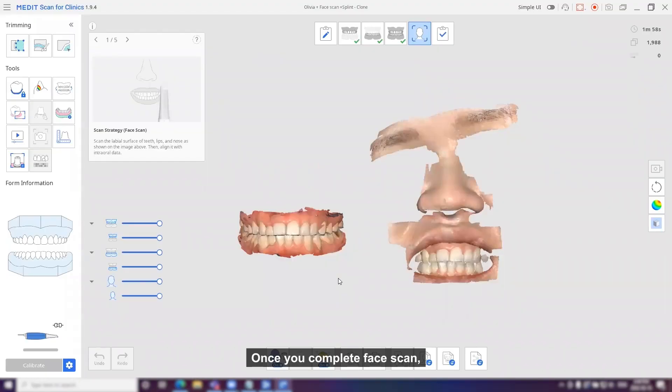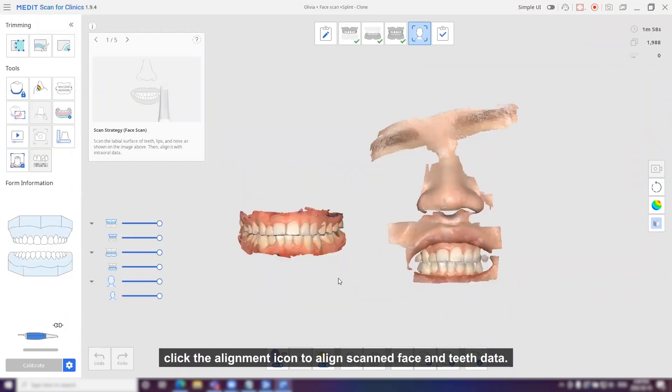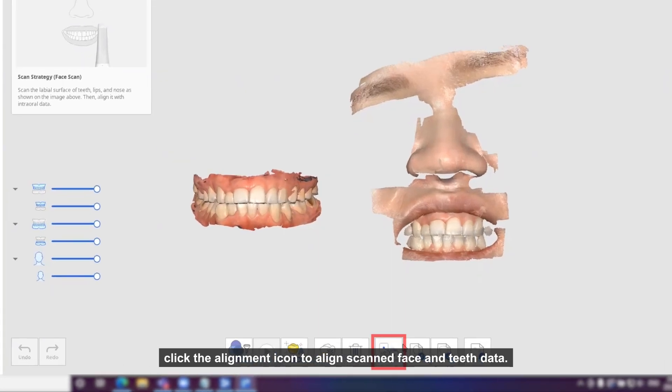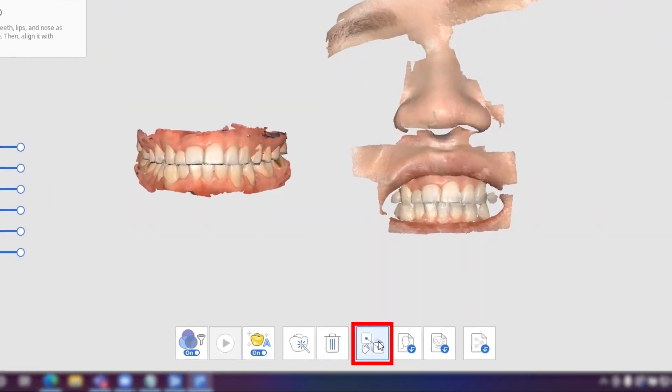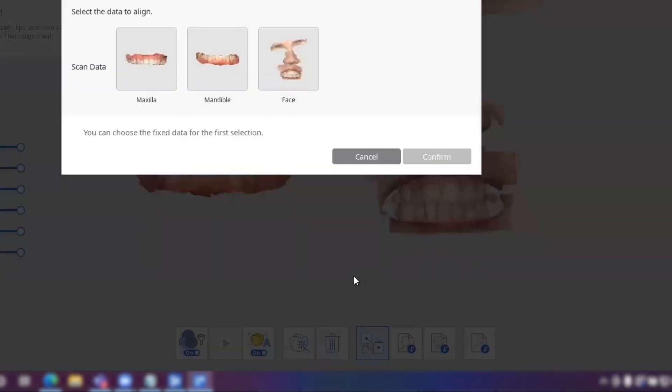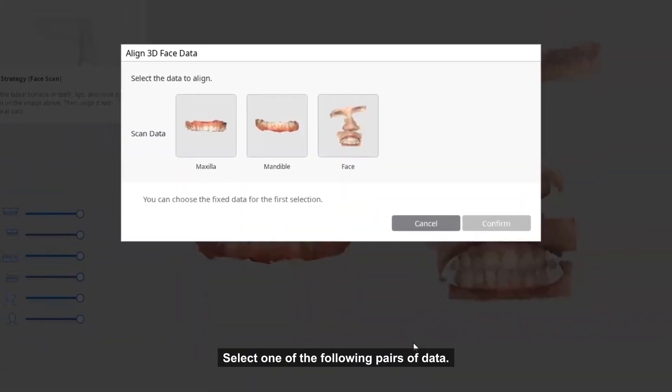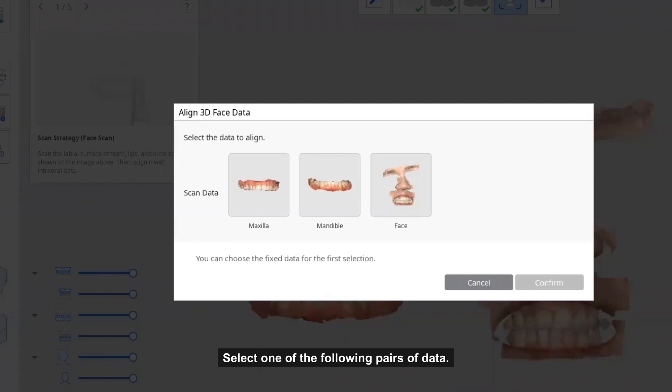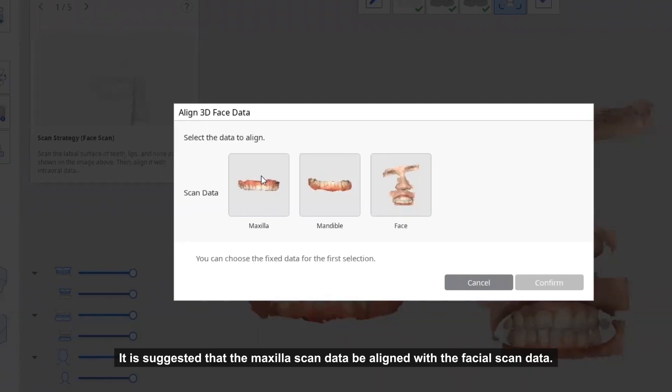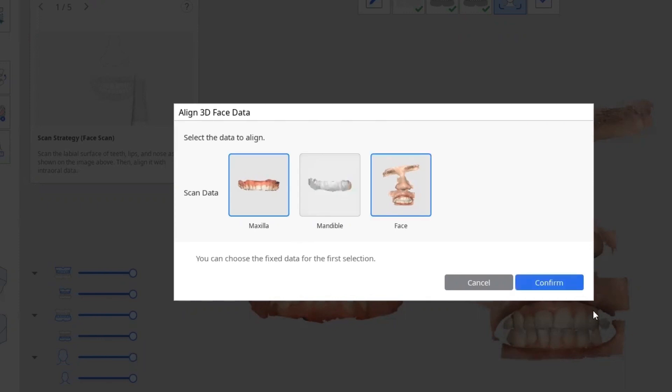Once you complete the face scan, click the alignment icon to align skin, face and teeth data. Select one of the following pairs of data. It is suggested that the maxilla scan data be aligned with the facial scan data. Click confirm.